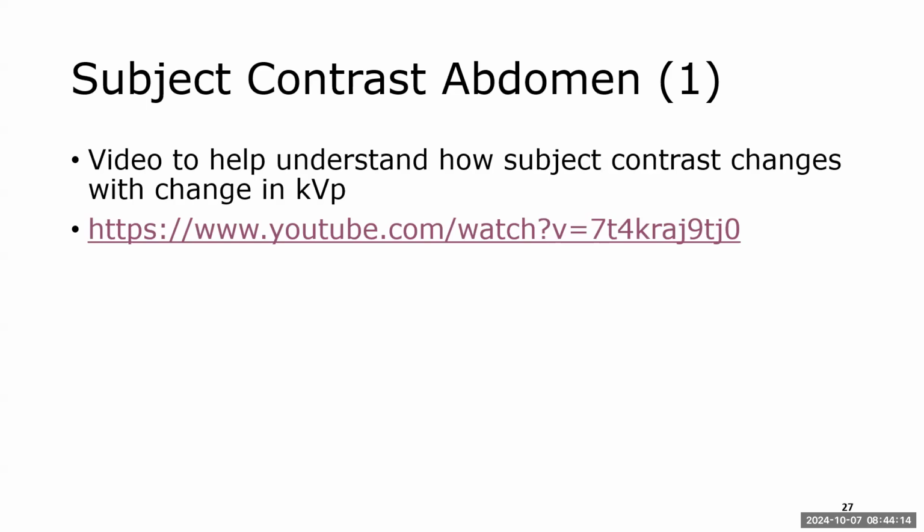So low kVp compared to higher kVp. That's the only thing that was different. But look at how it affects your subject contrast. Do you see the difference, especially like in this area right here? Y'all see that? How bright that area is?